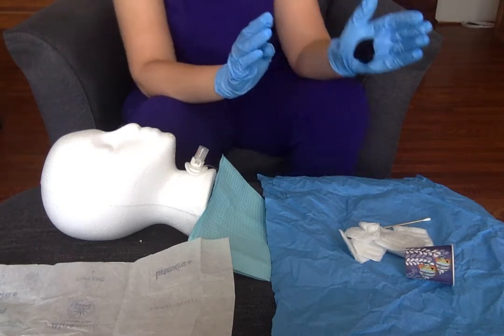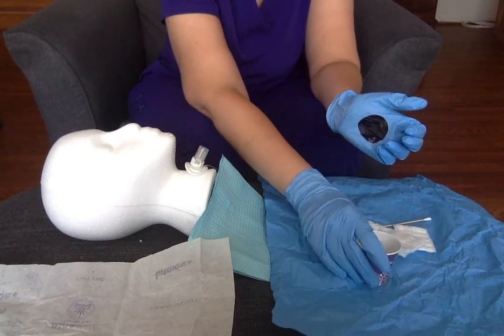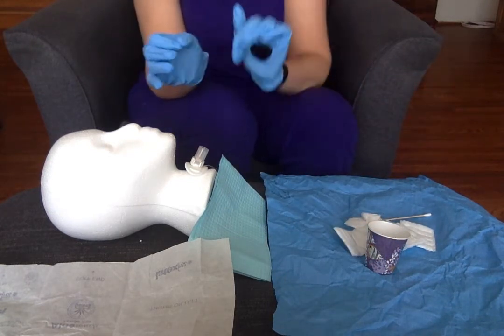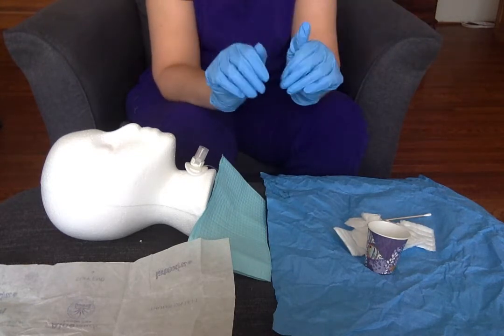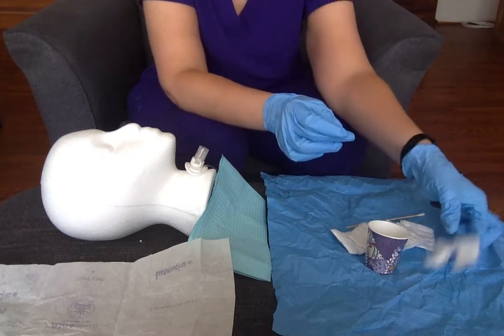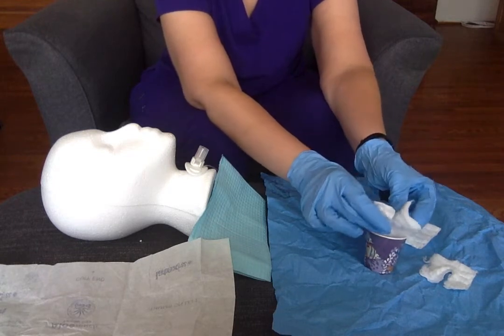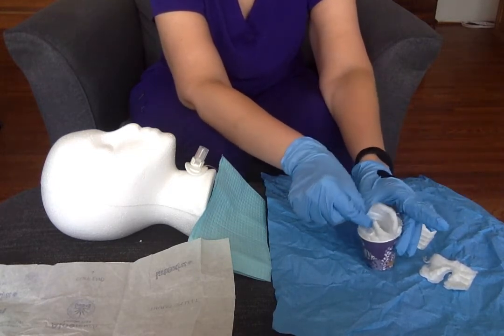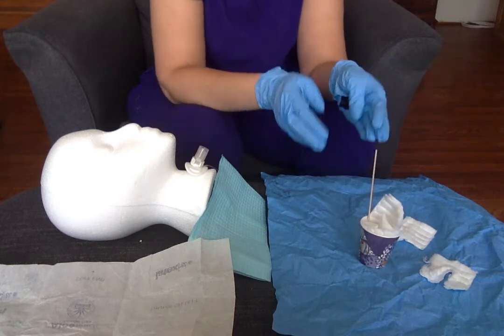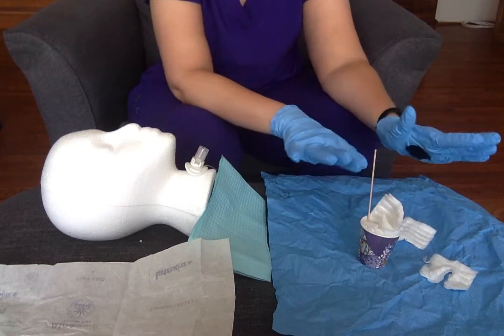I'm going to prepare everything in my tray. In mine I have my saline bottle here, so I can touch this. If I didn't have one in my kit, I would pull the gloves out, open up my saline, pour it in, then go ahead and sterile glove. I've got some gauze in here and my fenestrated dressing that we can use to replace at the very end. I'm going to take some of these gauze and put them into my saline solution to moisten them for cleaning. I also have cotton-tipped applicators, so I can go ahead and put them in. It's easiest to set up your whole kit while you are still sterile — sterile can touch sterile. I can touch everything in this kit right now.